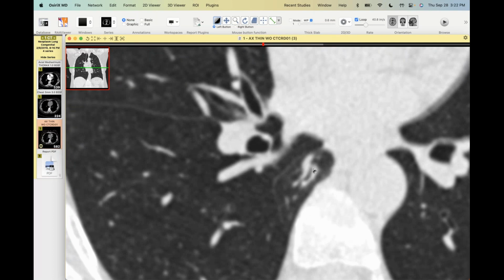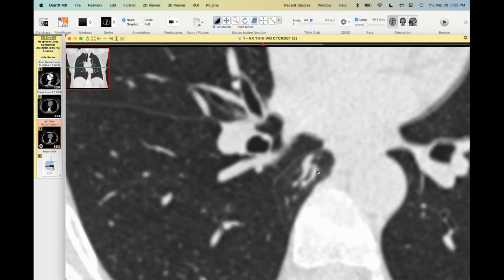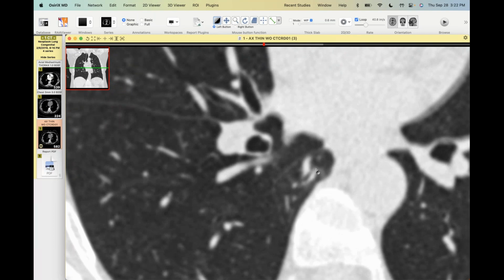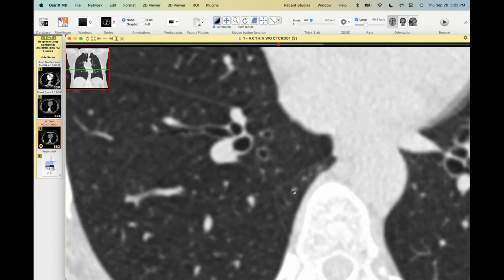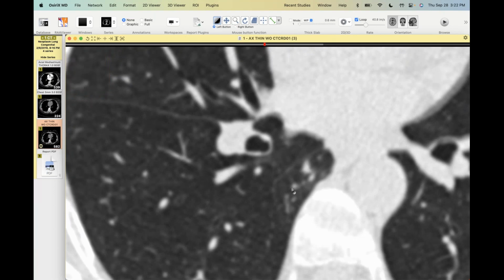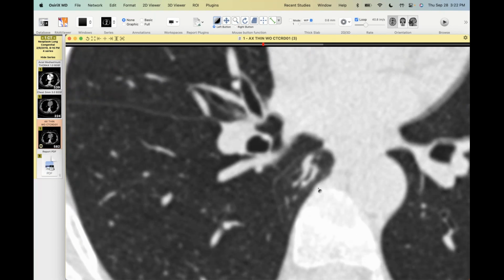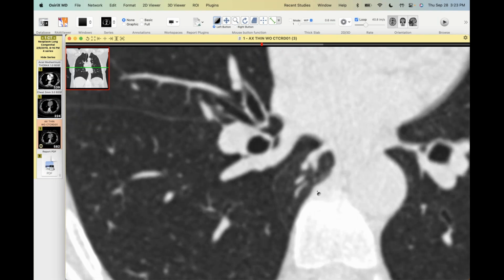Yeah, I agree. Extralobar should drain systemically, but maybe this is a sort of hybrid. So if we're going to call it sequestration, I think it fits better with extralobar, since it has its own pleura surrounding it. I guess I've never really thought about the lack of fissure for an intralobar sequestration, but there is not a fissure. Interesting. Okay, good. We'll have to go back and look at some of them. Let's call it extralobar sequestration in terms of having its own pleural envelope. That's part of the definition.